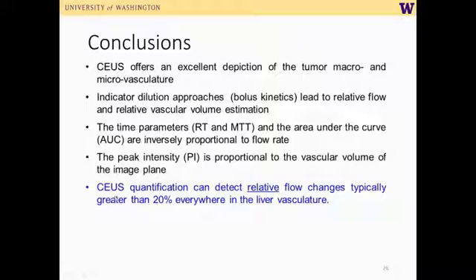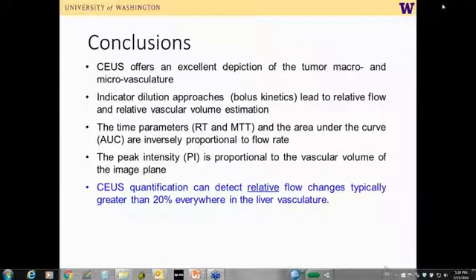Finally, as we saw from the work that was done on the machine-perfused pig livers, contrast-enhanced ultrasound quantification can detect relative flow changes, which are typically greater than 20% everywhere in the liver vasculature. With this, I have concluded my presentation, and I thank you for your attention.